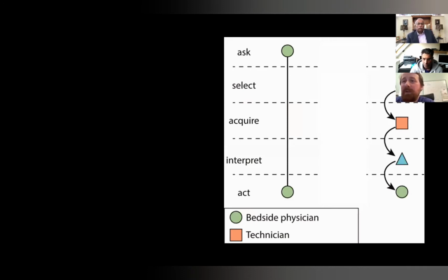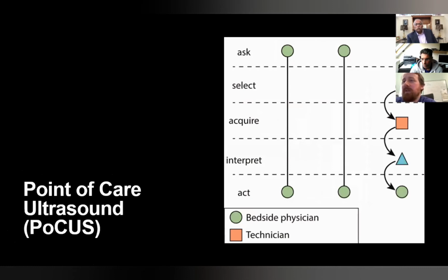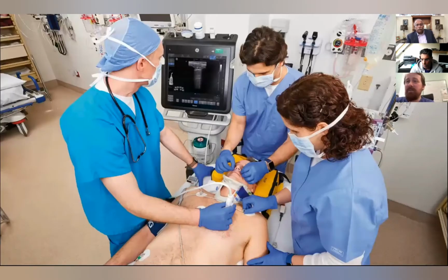The advantage of point of care ultrasound is that the person doing the history and examination, the primary physician, can do some focused ultrasonography to aid their clinical impression at the time that they're seeing the patient and acquiring the images. It takes out a step from the process. I would stress early in the talk that we're not looking to become ultrasonographers or radiologists. We're looking to do a very narrow investigation, to ask and answer a specific question at a specific point in time. Asking that question at that point means that you can affect management and then reassess. Point of care is something that I frequently do on a stepwise basis, reassessing the patients as you go.